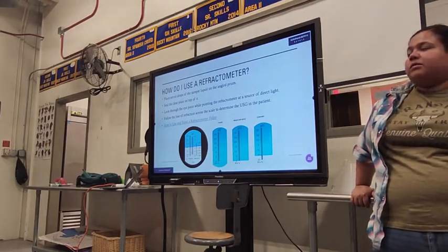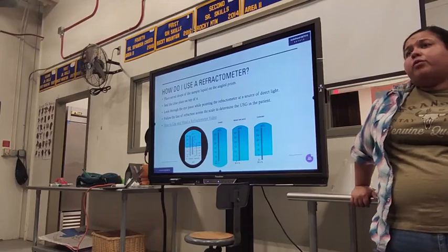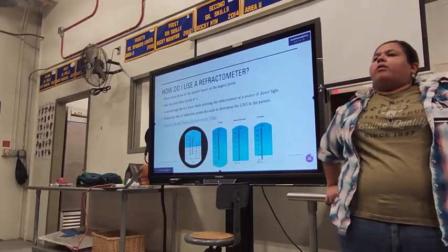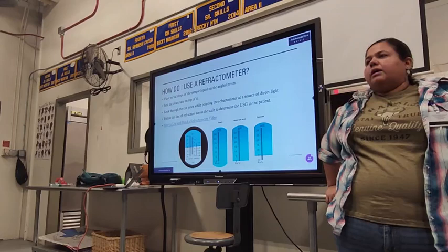focus on sometimes, okay? Do they ever move? The scale, do they ever move? Not the scale, but the urine within it. It doesn't. No, it shouldn't. It's not beaded.